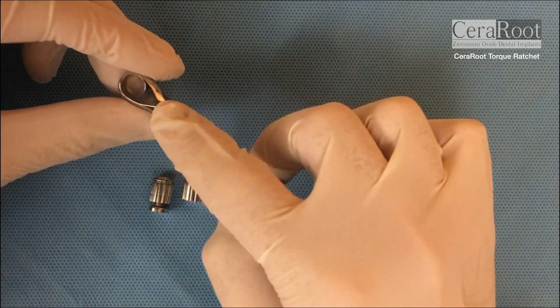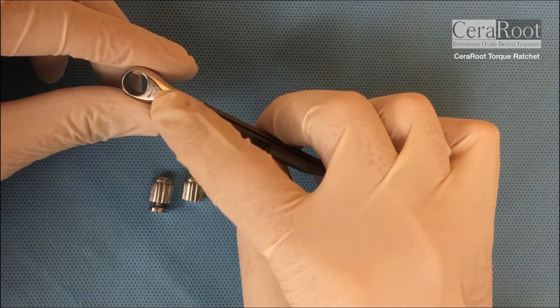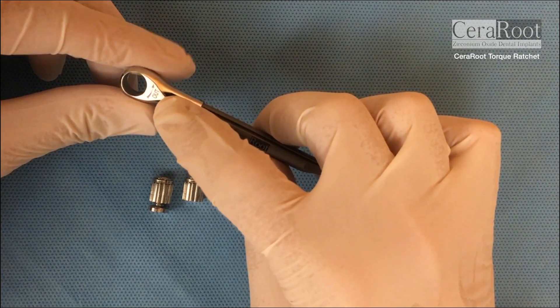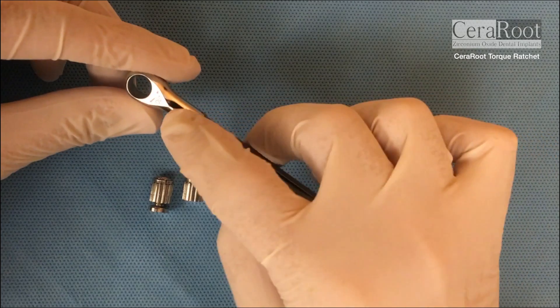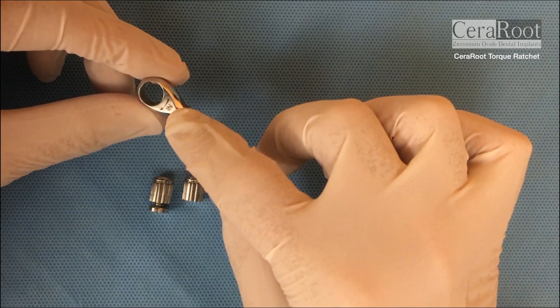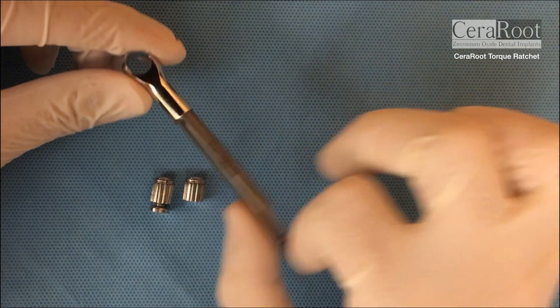So you have a description on the range. OUT means to unscrew the implant out, and then on the other side the word IN to screw in the implant.